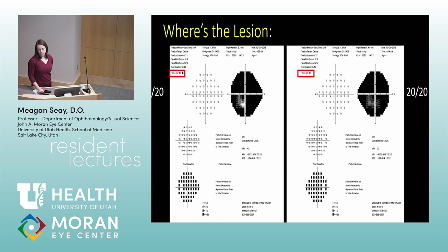Things that can result in profound peripheral vision loss, resulting in 20/20 vision, like severe glaucoma or RP. We were talking about what a CRA would do. Even if it's a robust cilioretinal artery, it probably wouldn't end up in 20/20 vision at the end. Bilateral would be unusual. A very lucky event for the person. Anything else? So you kind of label it as constriction with sparing of the macula.